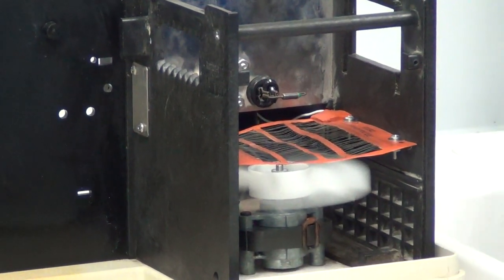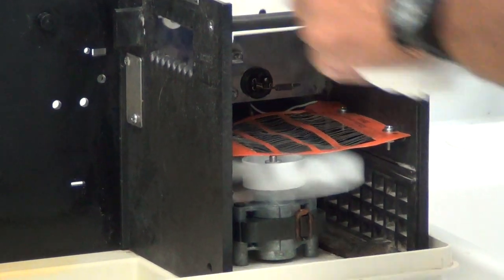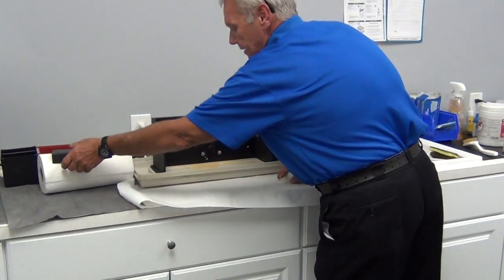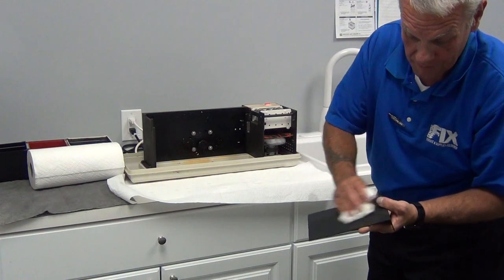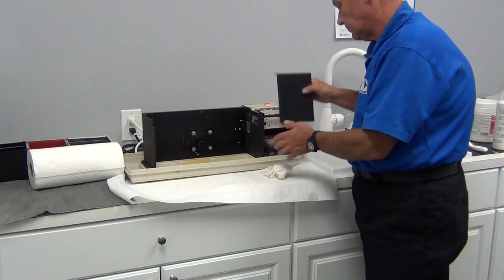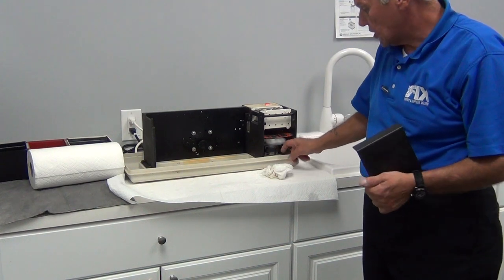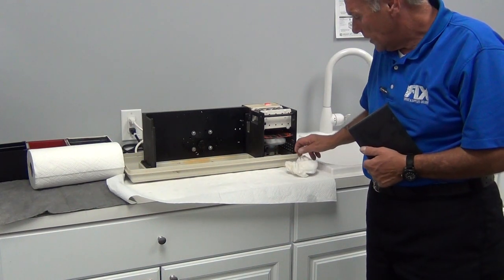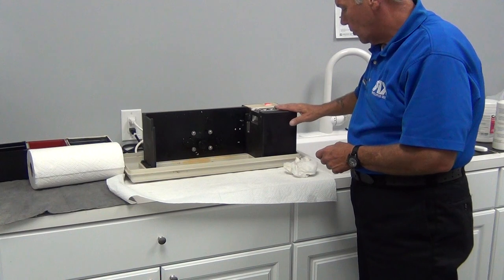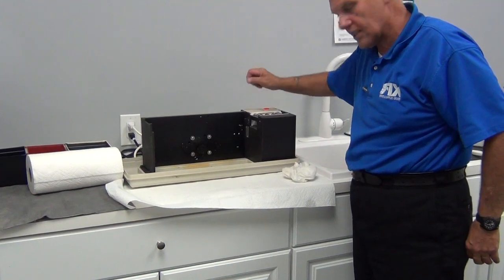We'll reinstall our dryer transport and reinstall the side baffle. After we wipe the side baffle down — remember, we want it to look good. Also, while you've got this apart, if you see an inordinate amount of dust in here, which more than nine times out of ten you will, take a vacuum cleaner and vacuum the dust out. The baffle directs the heat and makes the heat much more intense — that's what we want to feel.